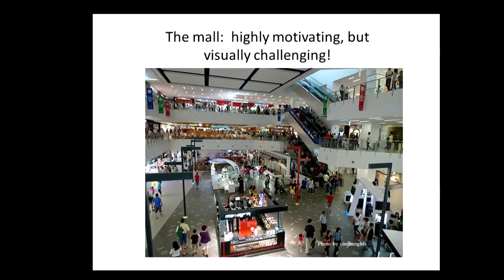When you think of that kind of space, what is it that makes it difficult for students to use devices? So, looking at a trip to the grocery store as one of those fun-filled trips, and knowing that students frequently are at the grocery store with their parents, having that conversation with parents that supports using devices while they're doing errands or grocery shopping. When the parent sees their child being successful with the device, being able to complete a task, the student figures out, Mom and Dad are supportive of this. They get how the device works and that I can be doing some of these things on my own.